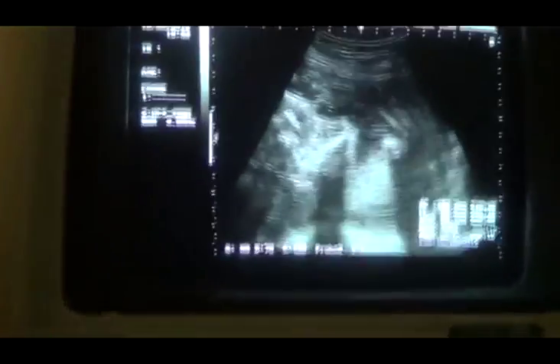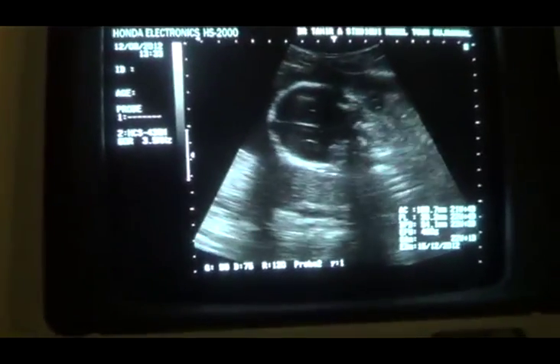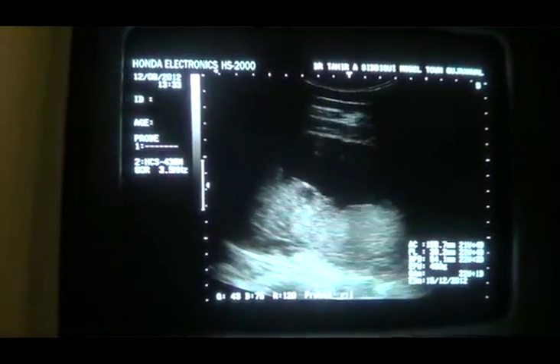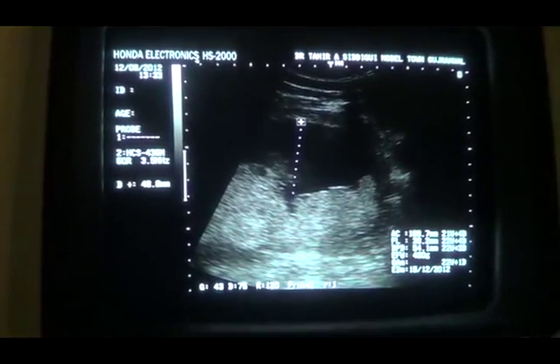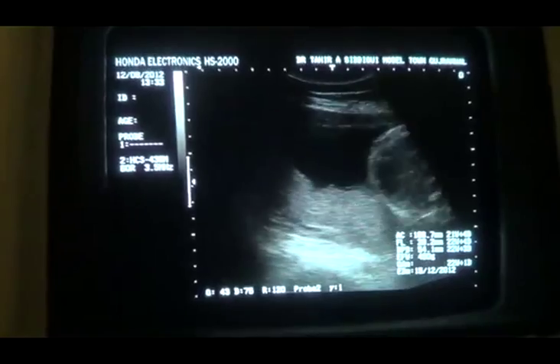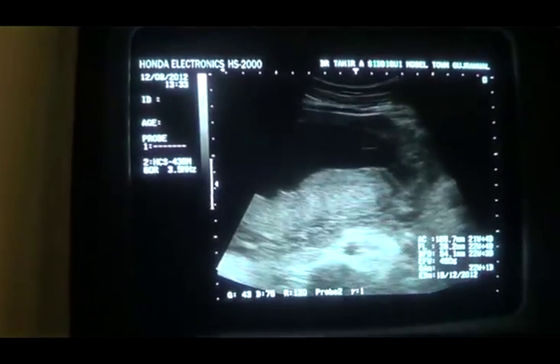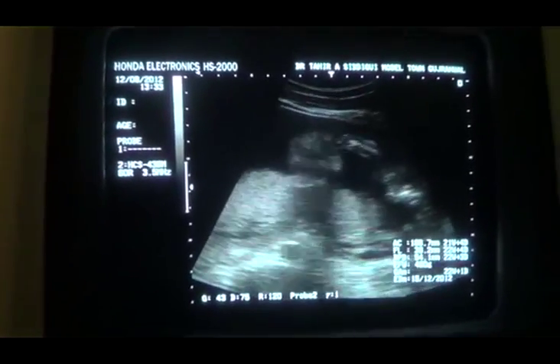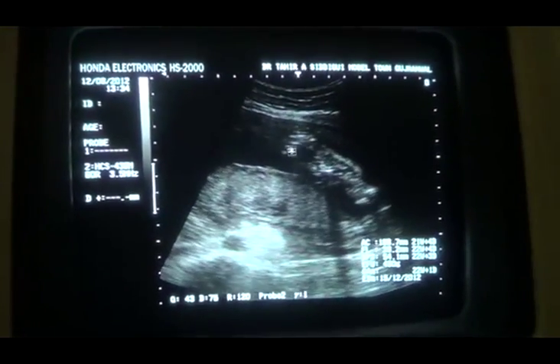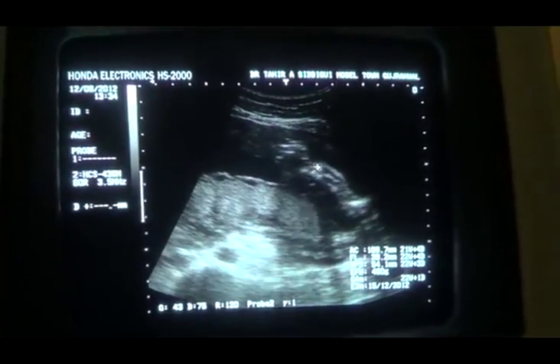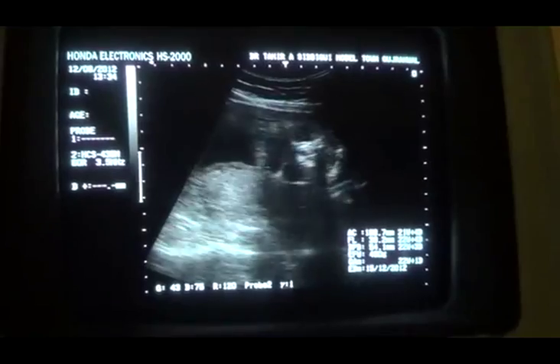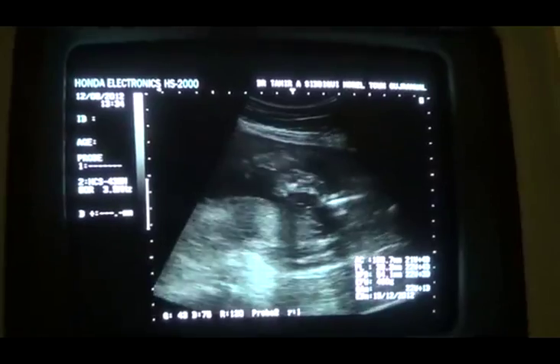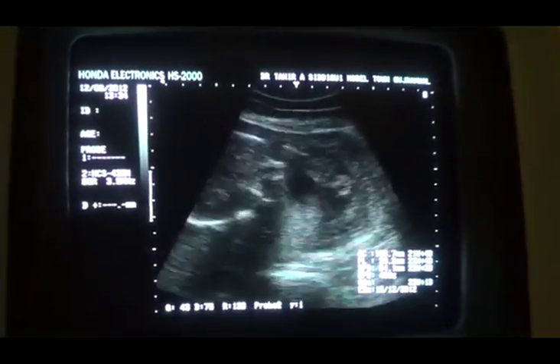The amniotic fluid pocket is 4.8 centimeters — it should be at least 4 — so it is within normal. Here you can see the movement of the limbs: this is the hand, this is the wrist joint, this is the arm. The fetal activity is present. The calcification of the bones is very normal.